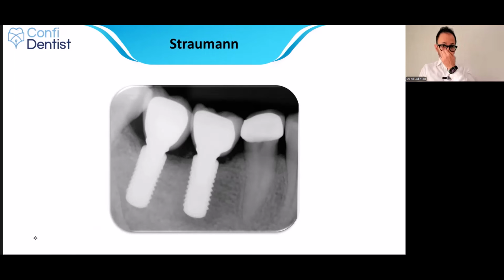Another example of a Straumann implant. Look at the cylindric design. This is the BL. Okay. Please note the platform switching. This step. Once I see this step, that's a no-brainer. It's proof that this is a case of a bone level implant.